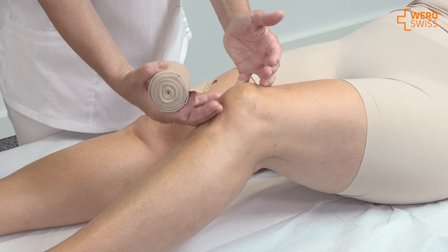Depending on how much you stretch the bandage, you get a firmer result on the bandaging, but it's still very flexible for the patient to move. I end the bandaging on top of the knee and use already made tapes to fasten and finish the bandaging.